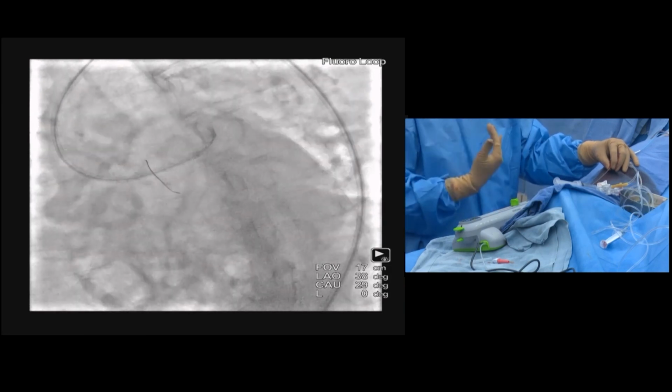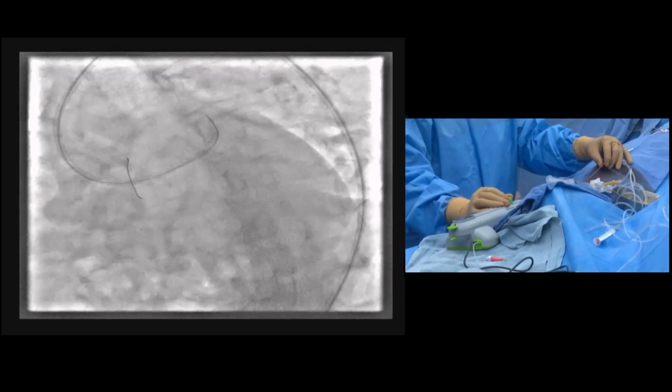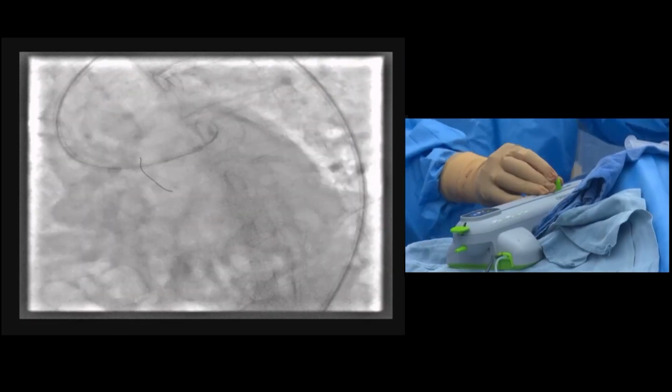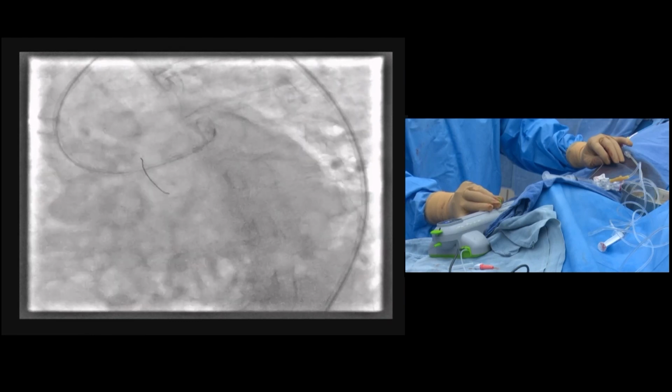The reverse cutting also should be with a slow speed, that is 1 mm, 1 mm, 1 mm, 1 mm. Now I am going with a reverse cutting. Now you can observe, very slowly we are moving. Now again, because of the beep, I stopped. Again we are giving some more interval. Now I am doing backward and forward cutting.